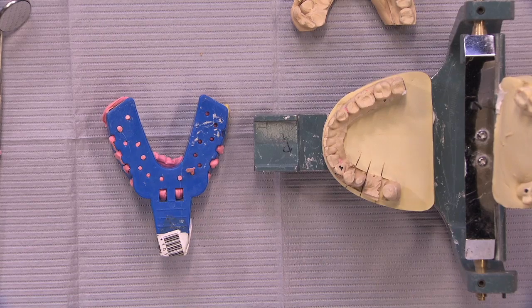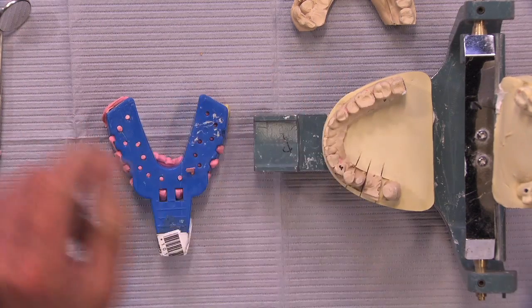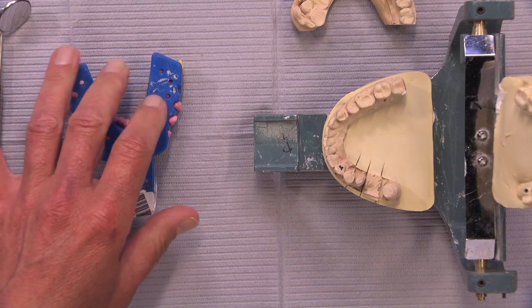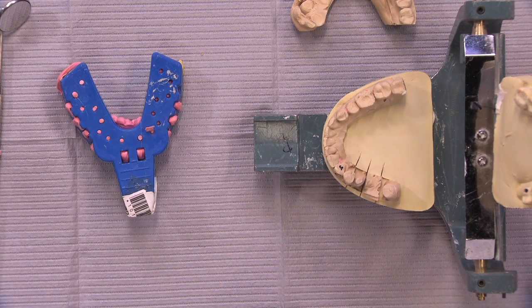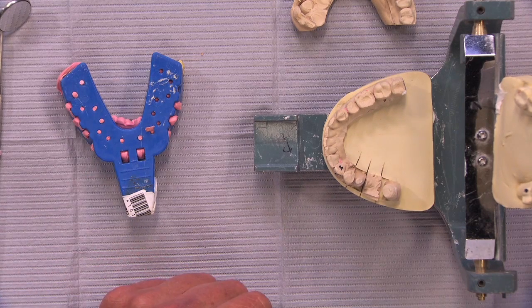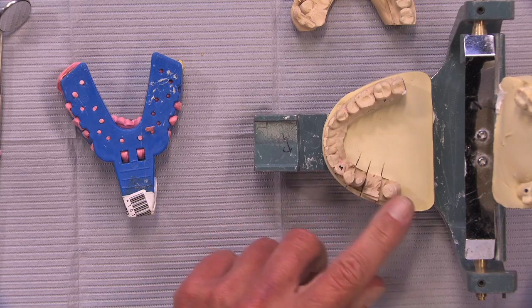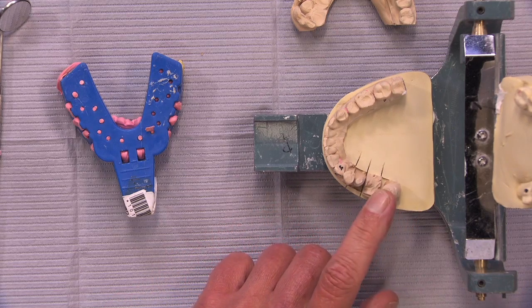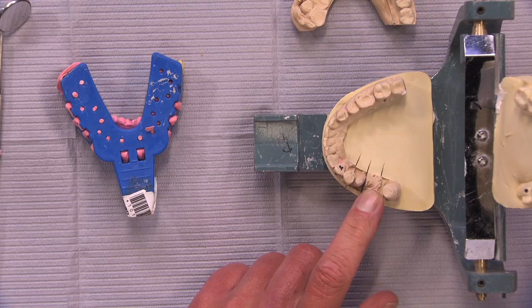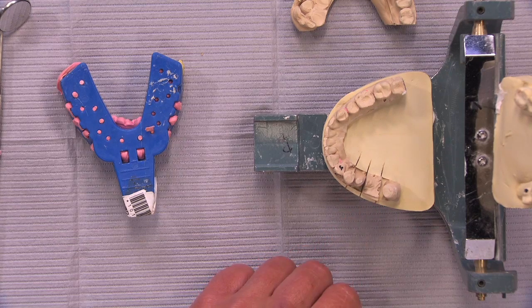I was walking through the BruxZir department the other day and saw an articulator that was sitting there and noticed something on it that I wanted to show you. We really pointed it out to each other and wanted to make sure it was something that you yourself, or maybe your assistant, would look for when you get a case back from us. So we've got a BruxZir bridge here going from tooth number 18 to tooth number 20 with a pontic for tooth number 19.